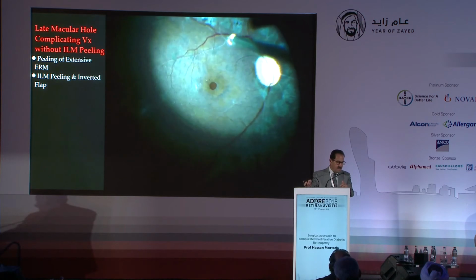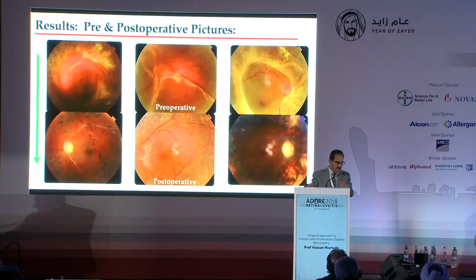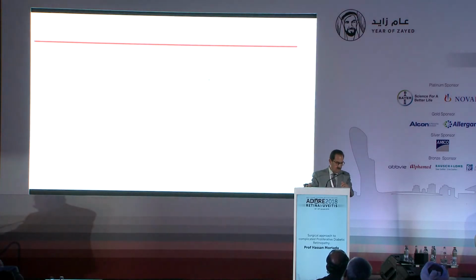And this is the case of macular hole developing 5 years after doing vitrectomy. And if I had removed the ILM, it would not have occurred. And this is the post-operative picture. So this is the pre and the post-operative pictures.